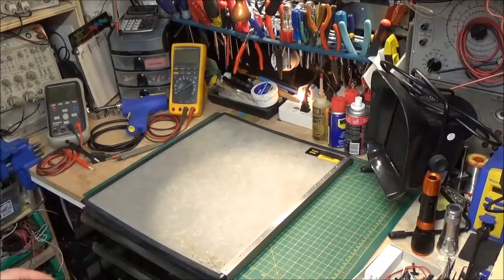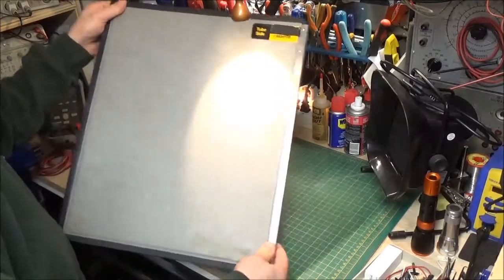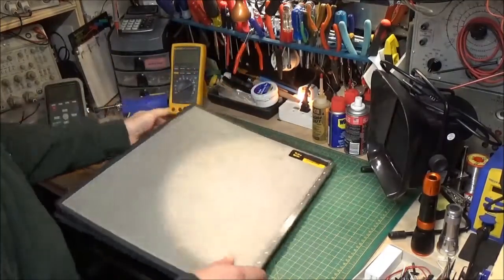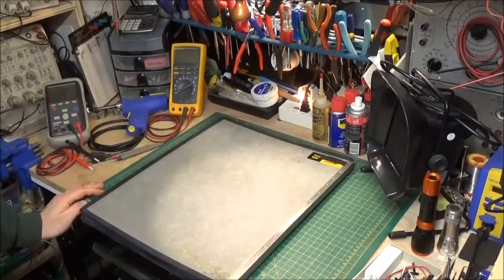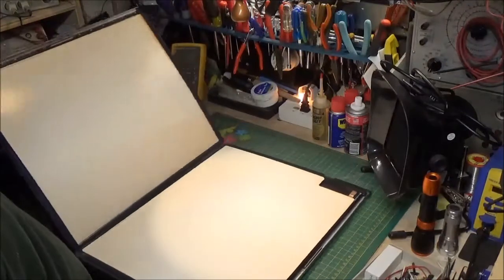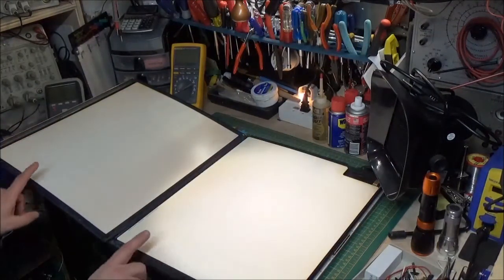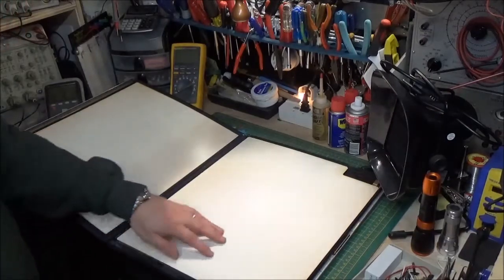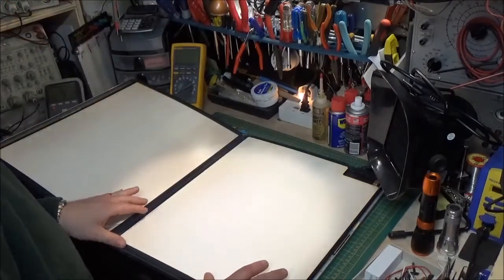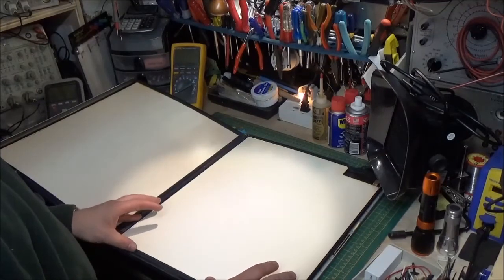We're going to start at the beginning, in the early days. Originally, the way a radiograph was taken was using something that looks kind of like this. This is a complete cassette — a radiographic x-ray cassette — and this is the thing that actually holds the film. The x-ray technician would open this up, place a piece of film in here, and it would be sandwiched between these two white sheets called intensifying screens. When radiation strikes them, they actually light up, converting an x-ray photon into light — pretty much a neon green color.